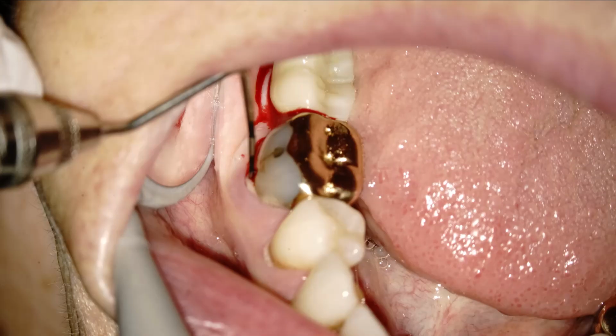The pocket probed no deeper than 2 millimeters, although there was bleeding and it was quite inflamed. The patient also presented with a 3/4 gold crown, a buccal pit amalgam with a shallow enamel limited crack.